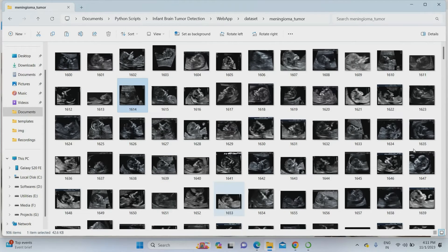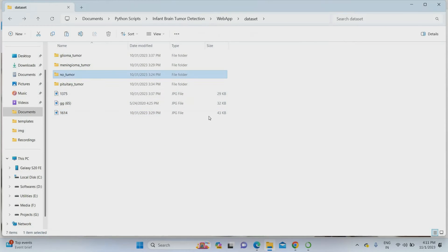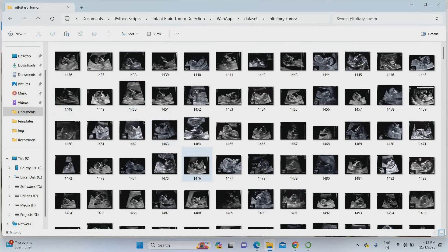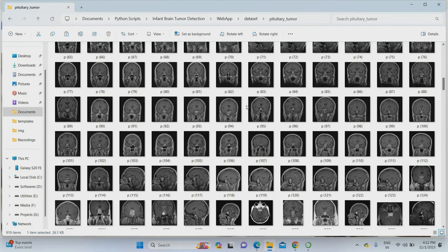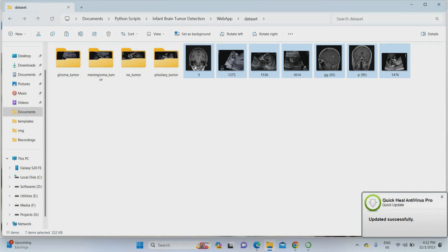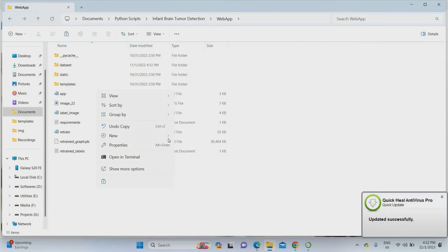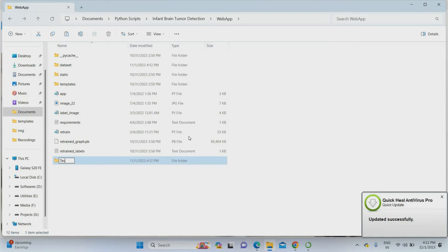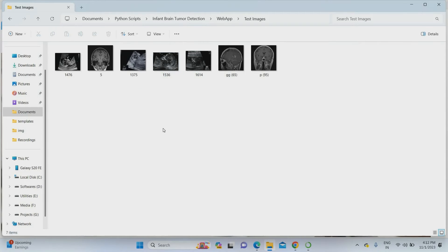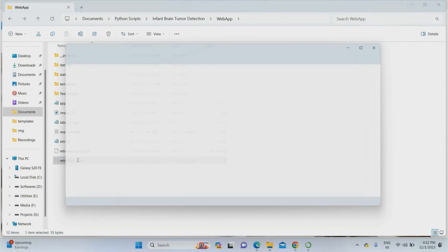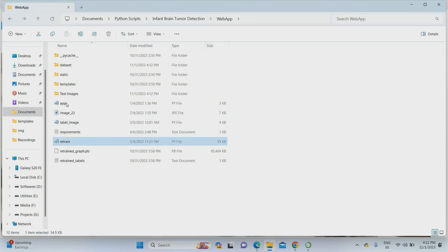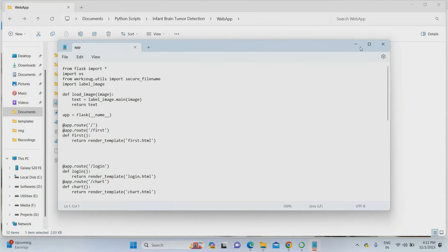For testing purpose, I am pasting some common images here — we don't know what type of tumor they have. I am also taking some no tumor reference images and pituitary tumor images for testing. You can check with any images from the internet, your X-ray images, MRI images, or ultrasound images — it will work perfectly. The project is already trained. You can check the retrained labels: glioma, meningioma, no tumor, pituitary tumor — already trained. The coding files are: label.image, retrain.py, and app.py. app.py is the main code I am going to run.